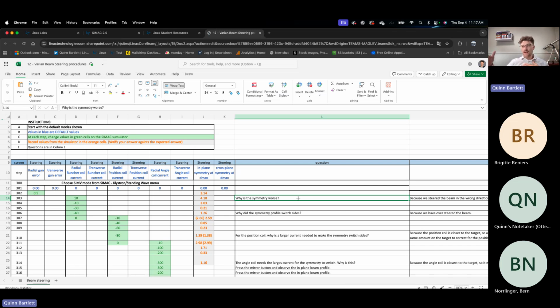So it really will take you through beam steering, first of all. Second of all, it'll help you understand where to find things on the simulator, really just how to use the simulator and become familiar with it. And then third, it'll take you through these questions and make you understand the phenomenon behind the changes that we're making to our simulator and to our beamline.